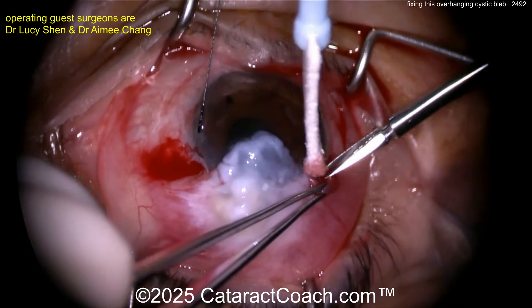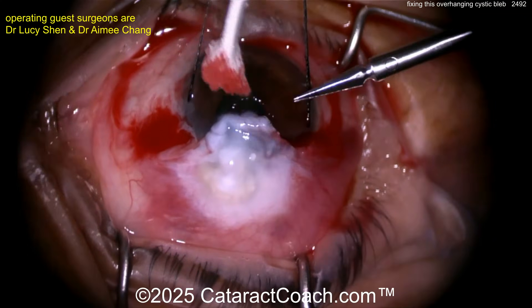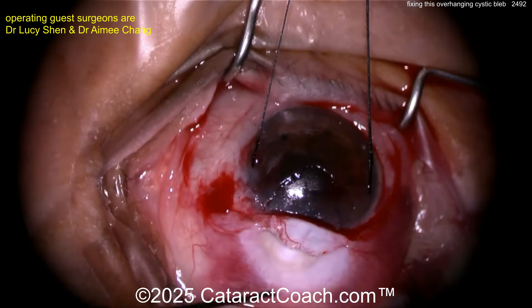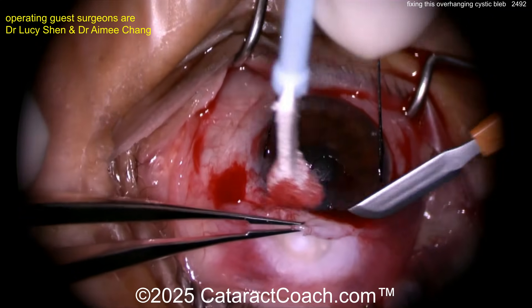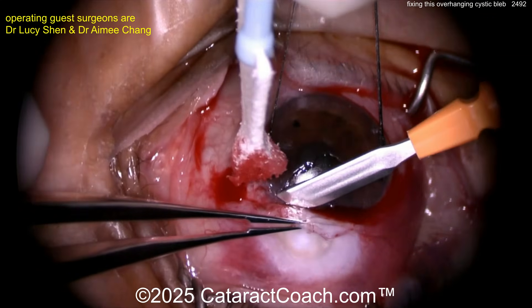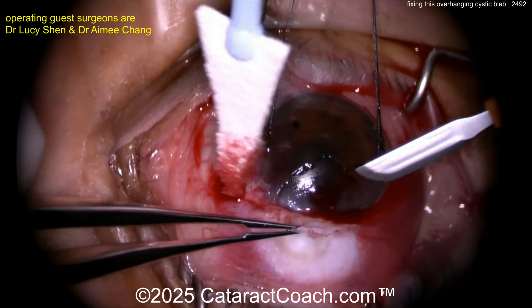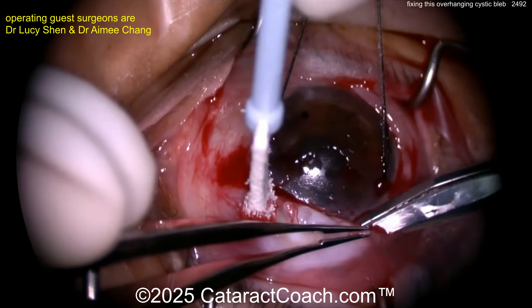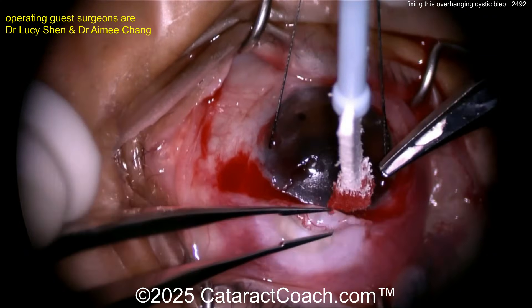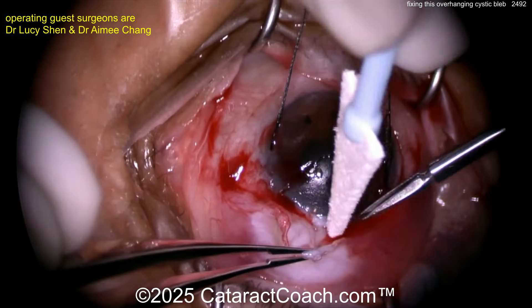Starting off with a limited peritomy, carefully peeling the bleb off the cornea. The bleb is already leaking at the limbus — look at the fluid leaking out. Using a 67 blade to dissect the superficial layer, freeing up the conjunctiva posteriorly first, then freeing it off the sclera. Nice and easy, taking your time — there will be a lot of scar tissue posteriorly.